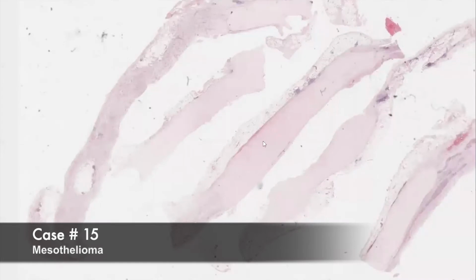Our next case here is from the pleura. So if we look here, we can see an area of a pleural plaque. So we have this dense collagenous fibrous tissue that really has this nice layered appearance to it with these interspersed holes that are characteristic, called a basket weave appearance, that's consistent with a pleural plaque, which is typically seen in patients that are exposed to asbestos.